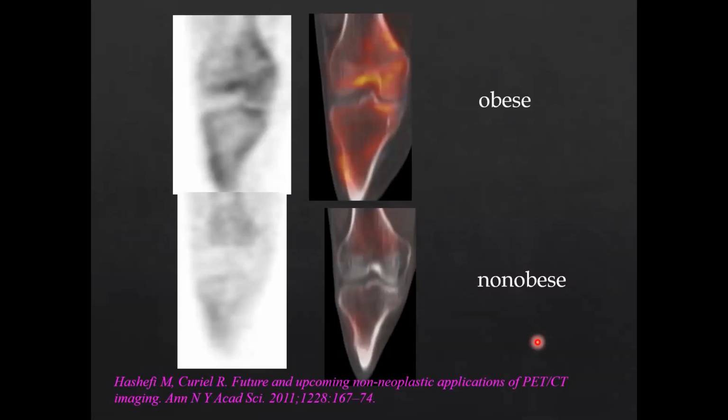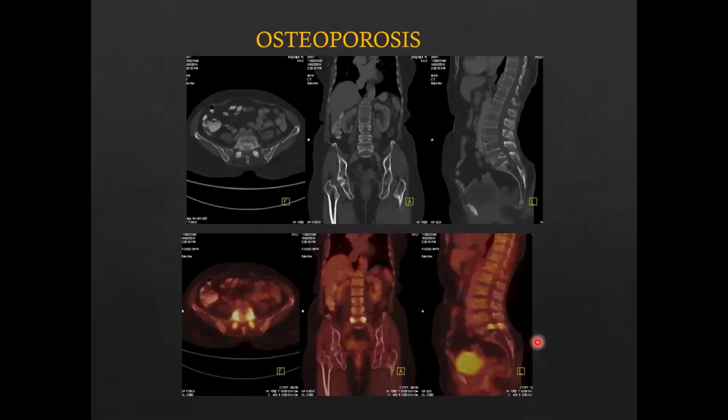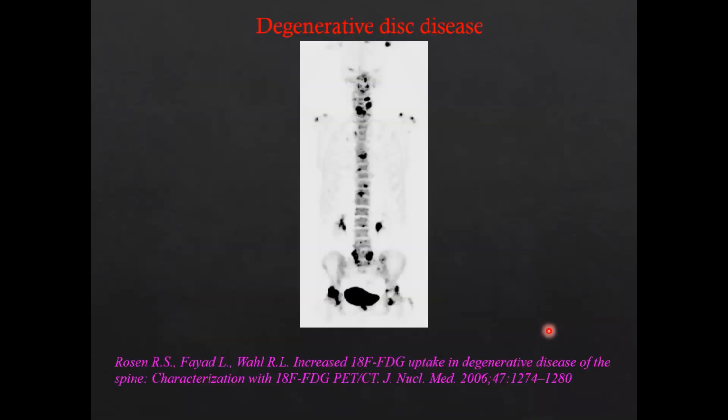So coming to osteoporosis, this is significant bone osteoporosis, absolutely nothing. If you see, other than osteopenia, there is no uptake, but only the focal area of facetal arthropathy or hypertrophy, probably in the lower lumbar region, because of weight bearing, gives an increased amount of uptake. That is also one of the things, because of the more continuous stress, movement, activity and weight bearing, this results in increased uptake. Otherwise, it doesn't have any significant relevance.